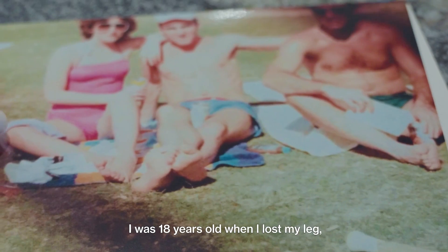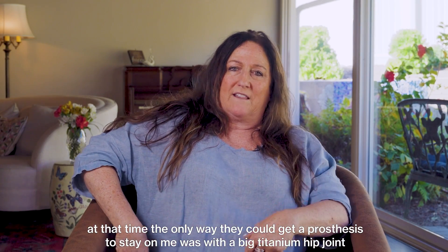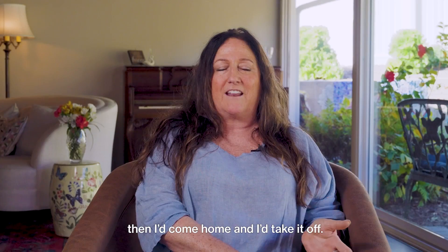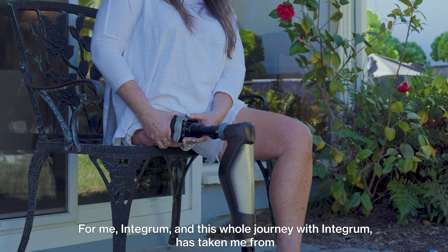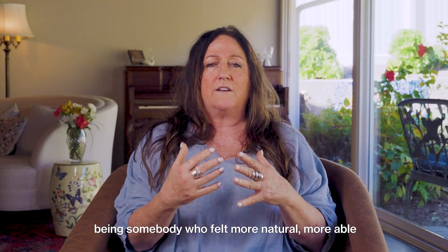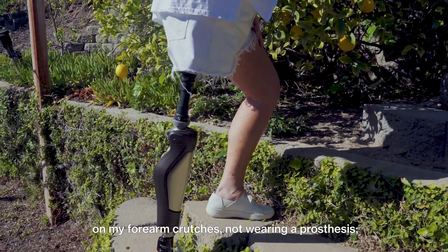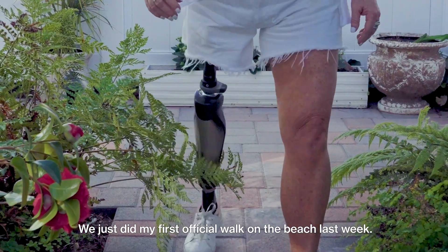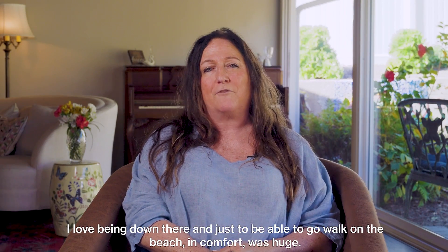I was 18 years old when I lost my leg. At that time, the only way to keep a prosthesis on me was with a big titanium hip joint and a thick leather belt around my waist, so I really never wore my prosthesis much — I'd wear it when I had to and go through most of college without it. Integrum has taken me from being someone who felt more natural on forearm crutches to now being someone who feels more natural wearing this prosthesis. We just did my first official walk on the beach last week — to walk on the beach in comfort was huge.